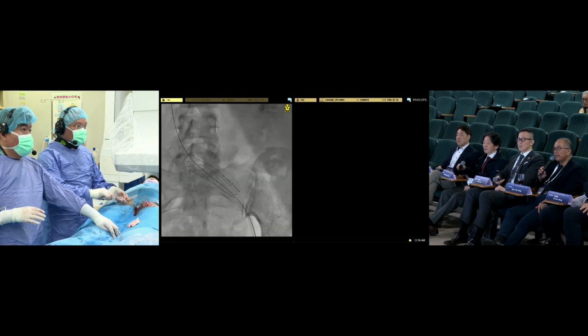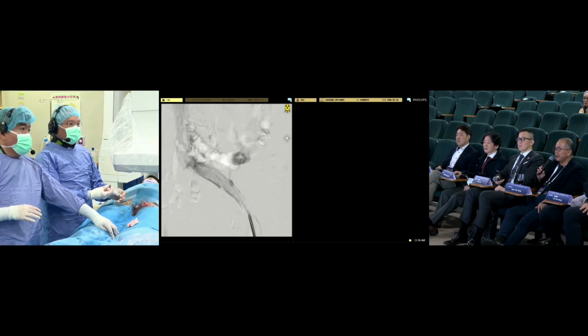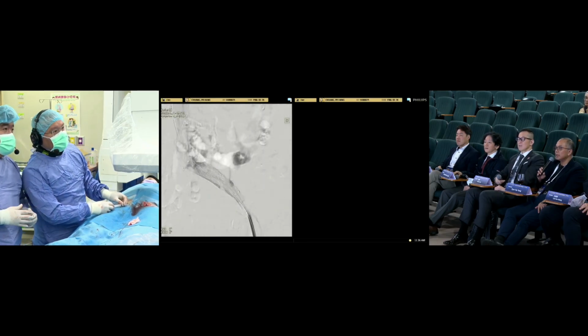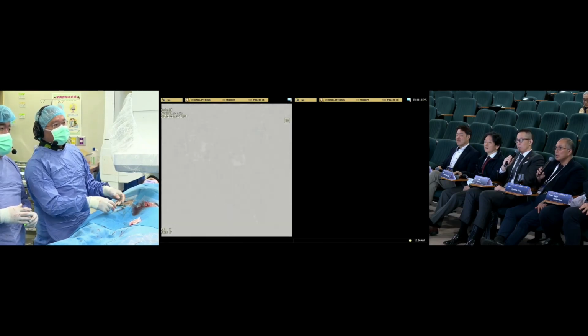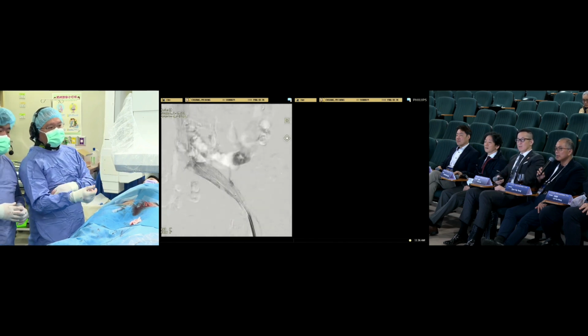Do you think that's long enough, that stent? Are you going to leave that stent at that posture, because it's in a very correct obtuse angle? Good position. This collateral disappears. Congratulations. So, do you post-dilate after this? Yeah, do you post-dilate?